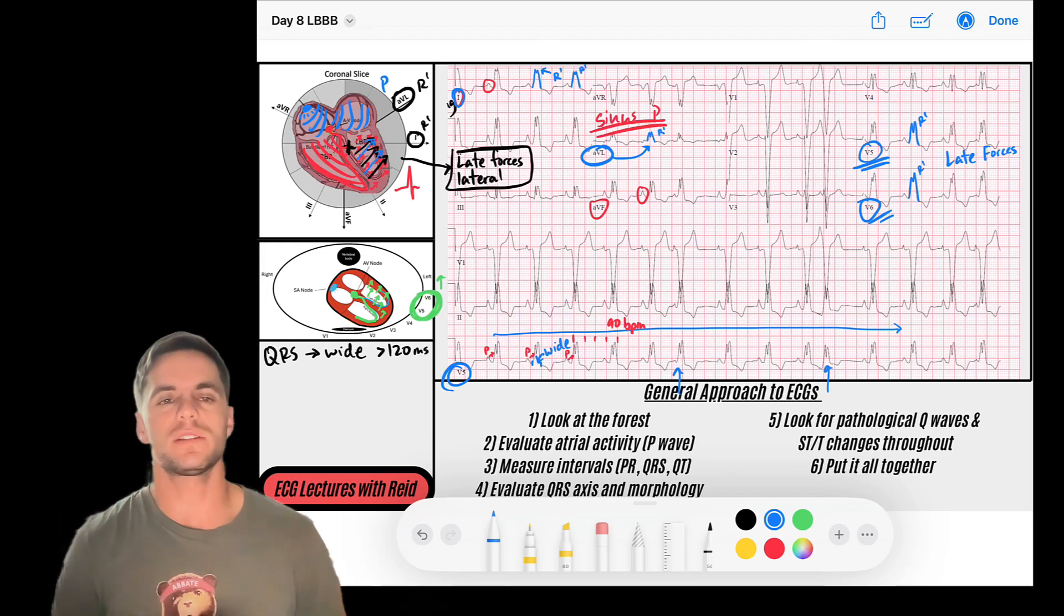So that's a really important wave to look for. It doesn't always have to be present in leads 1, AVL, V5, and V6. Those are our lateral leads, but it should be present in at least two of them. That's usually the case.